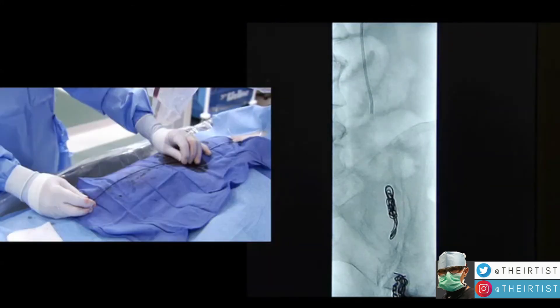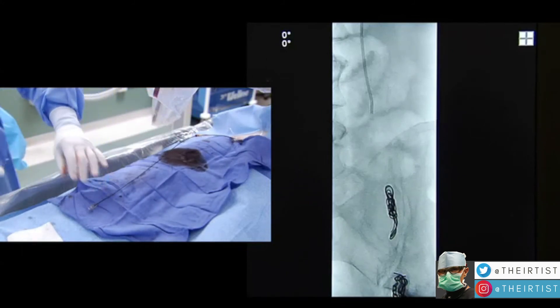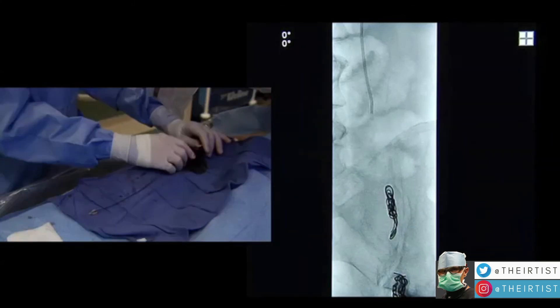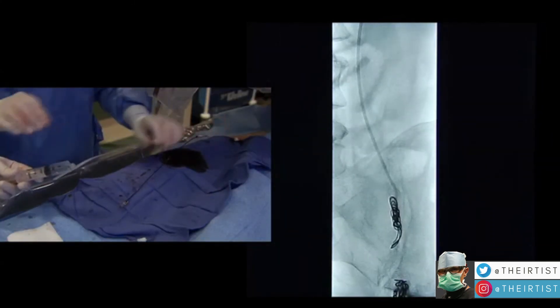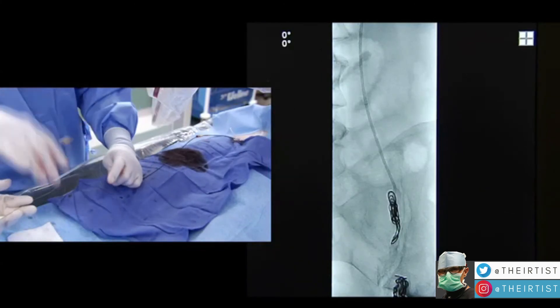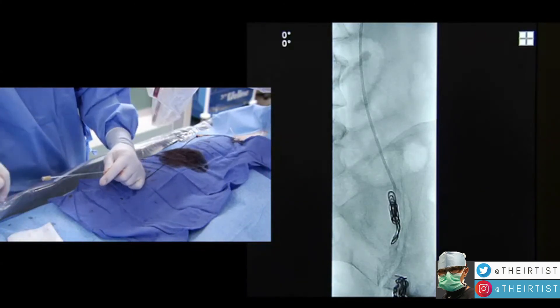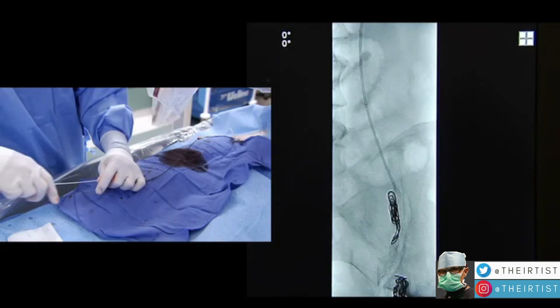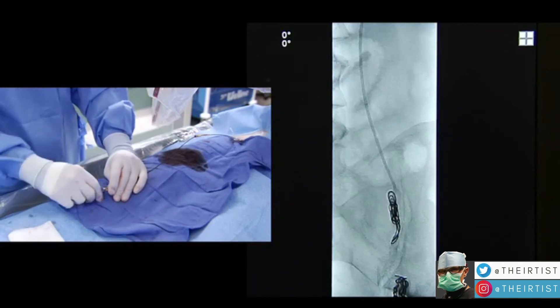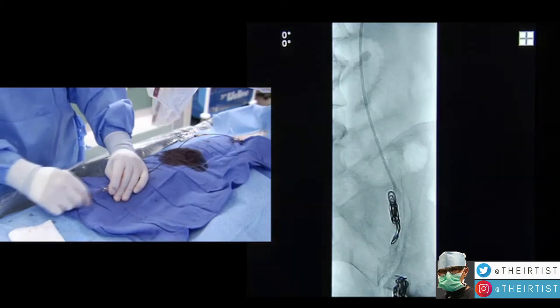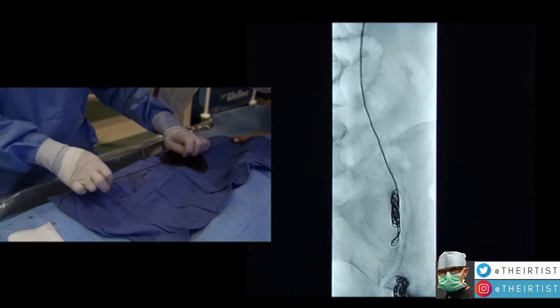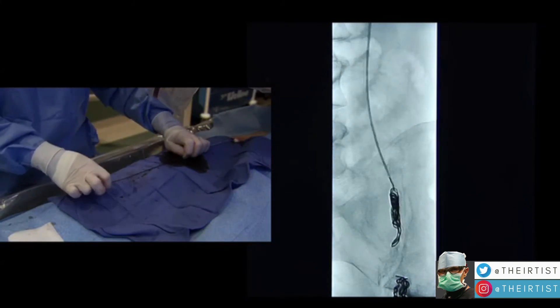The catheter is retracted. The physician adds one more coil to block the remaining vein. Once the coil is placed, the procedure is nearing successful completion with no major risks or major side effects for the patient.